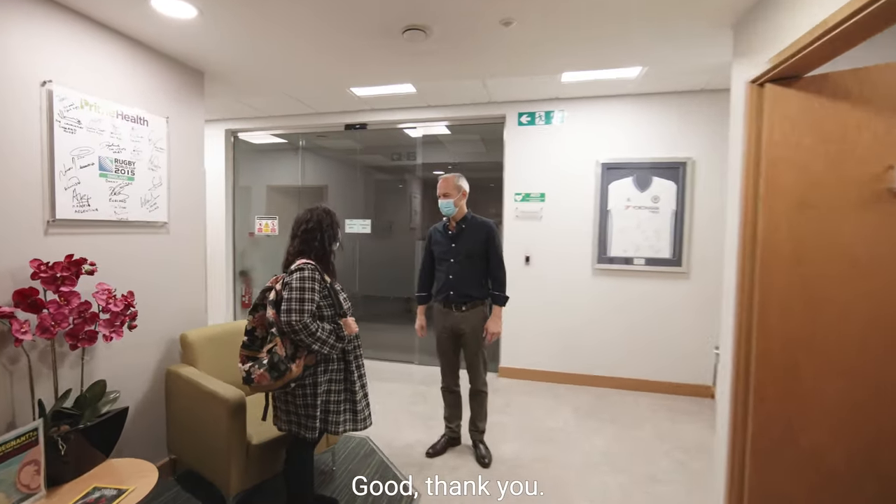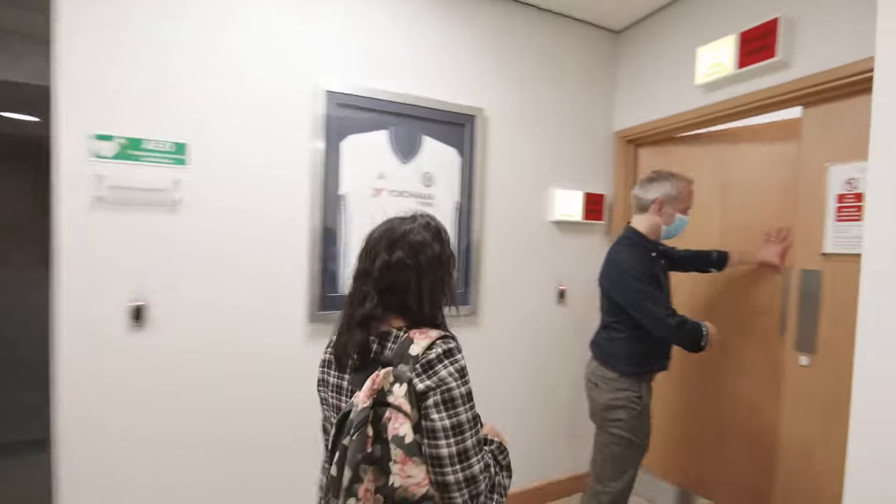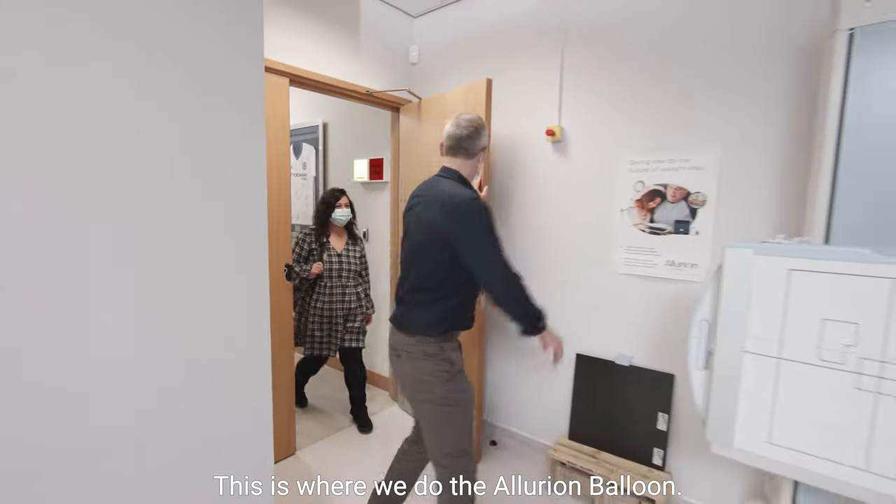Hi Georgie, how are you? Good, thank you. Are you all set? Yep. Let's go. Welcome to the x-ray suite. This is where we do the Allurion balloon.